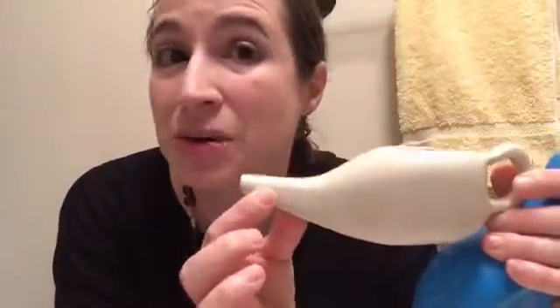So this is mine. It's backwards on your screen, but it says Rojo. I've got my very own personal one. I've also got a couple others here for demonstration, just to show that these things come in different shapes, varieties, and sizes. So here's another variety. And if you like ceramic, there's another variety here as well. Obviously ones that are ceramic tend to last a bit longer. Just don't drop it, from personal experience.